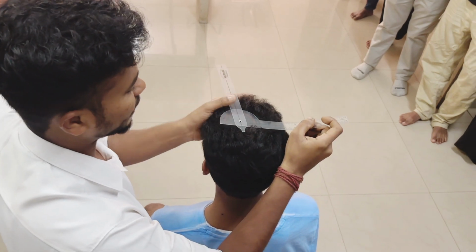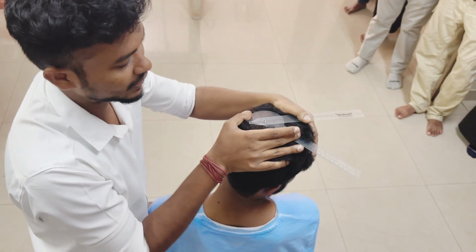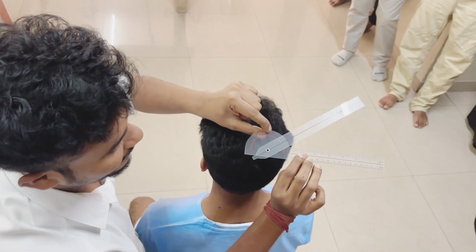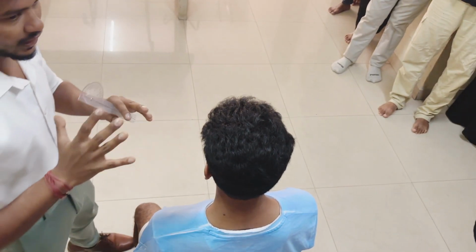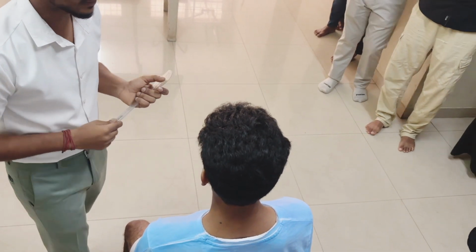Then we ask the patient to do the rotation movement. When the patient does rotation, we see the range from 90 degrees, how much it can go. That is the rotation movement. So like this we can measure cervical spine ROMs with a universal goniometer. Clear?